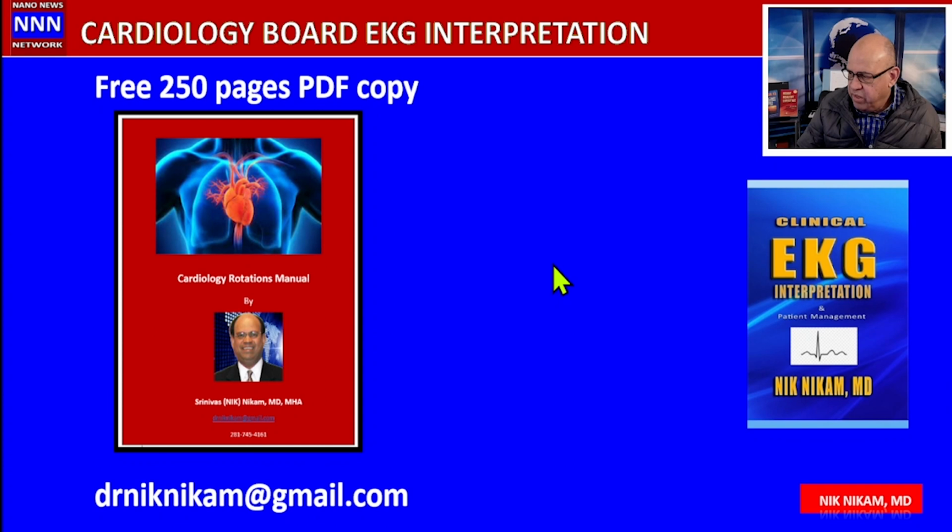So, ladies and gentlemen, this is a quick overview of the conduction disturbances with reference to the cardiology board exam EKG interpretation.